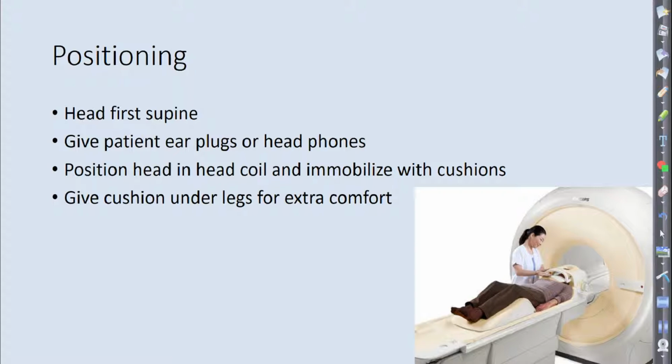And you can readjust the head coil some ways. You can kind of prop a sponge under it sometimes, kind of adjust for certain positioning needs. But if they can't lay flat for 30 minutes, this is going to be a hard test for them.